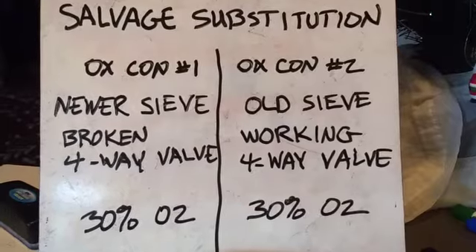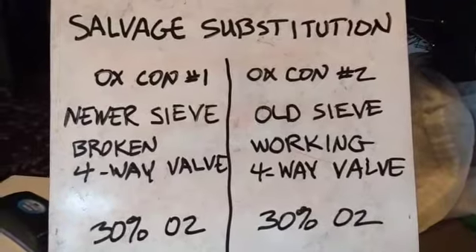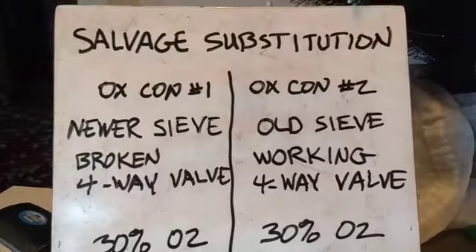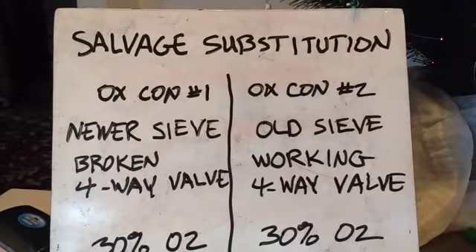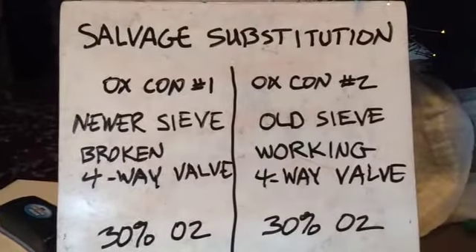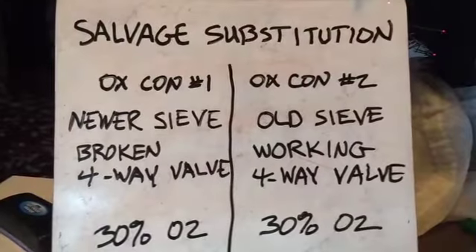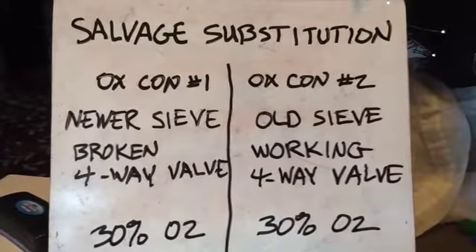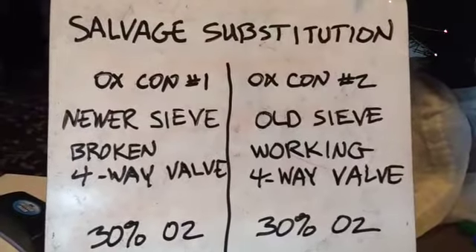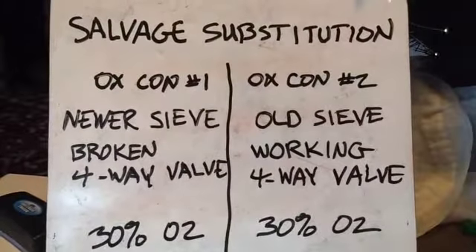Let's discuss improvisational testing. Salvage substitution is probably one of the most common things that we do. Say we have two oxygen concentrators, neither one of which puts out adequate oxygen. Say they're both 30% O2. But oxygen concentrator 1 has a newer sieve, fewer hours, but a broken four-way valve. Concentrator 2 has high hours, an old sieve, and a working four-way valve.